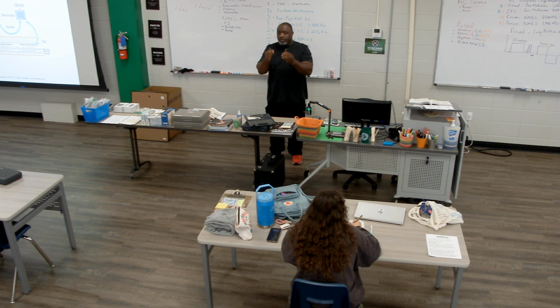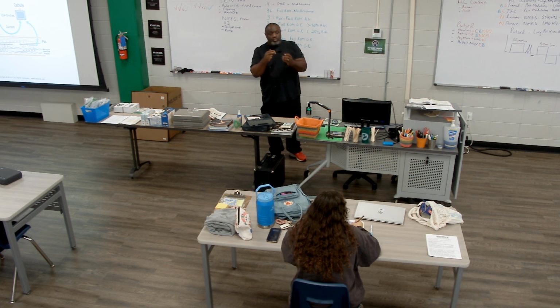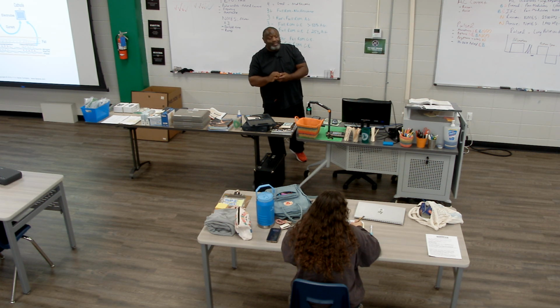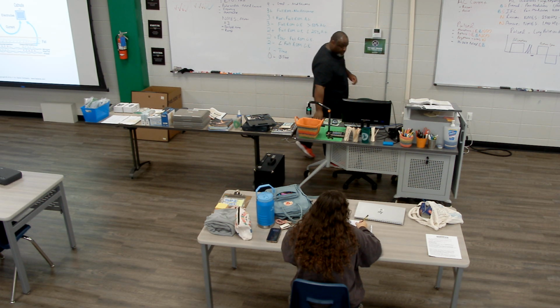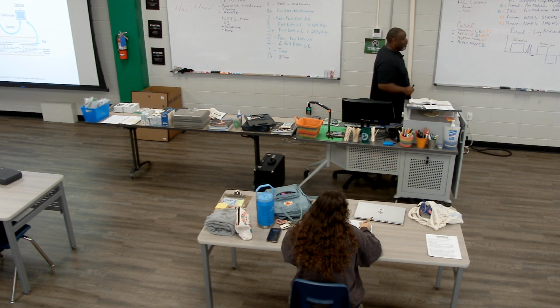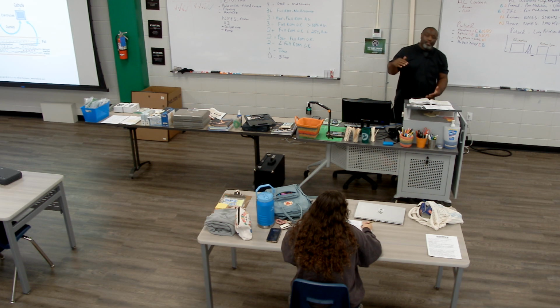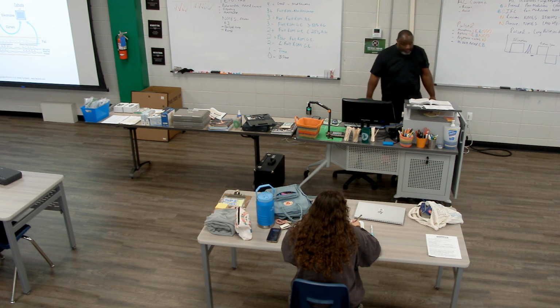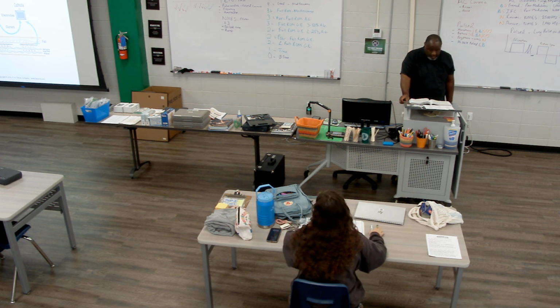Red is your anode, black is your cathode. So the black is the one that current will draw to easier, because it's negative and it's going to draw toward the positively charged nerve cell. Remember, the cell is positive outside, negative inside. Okay?